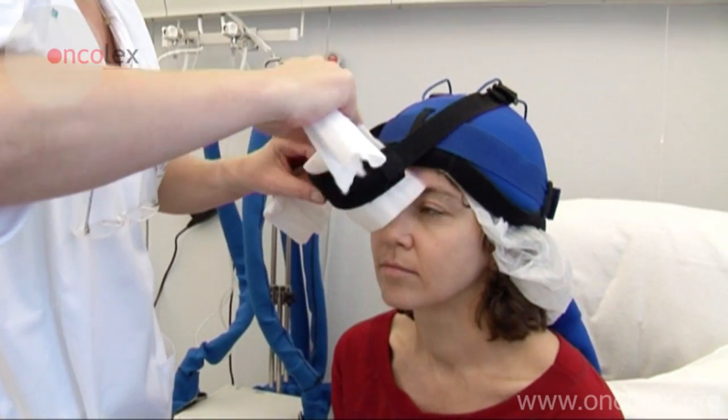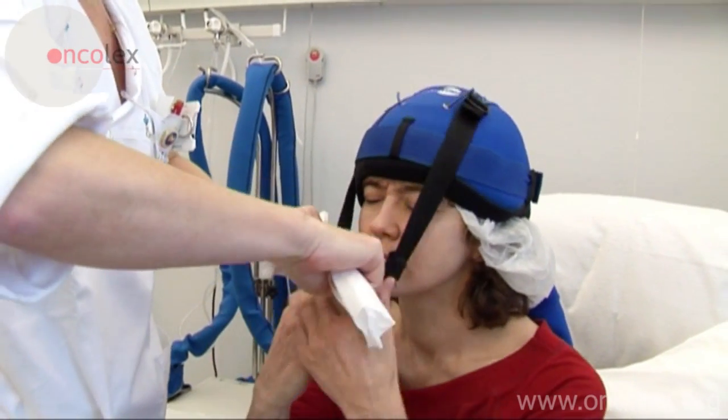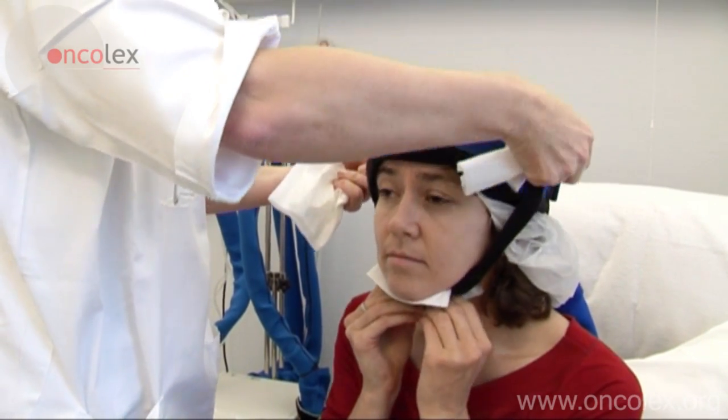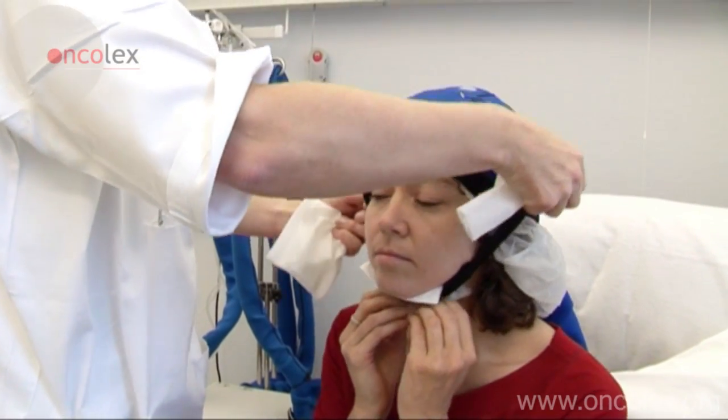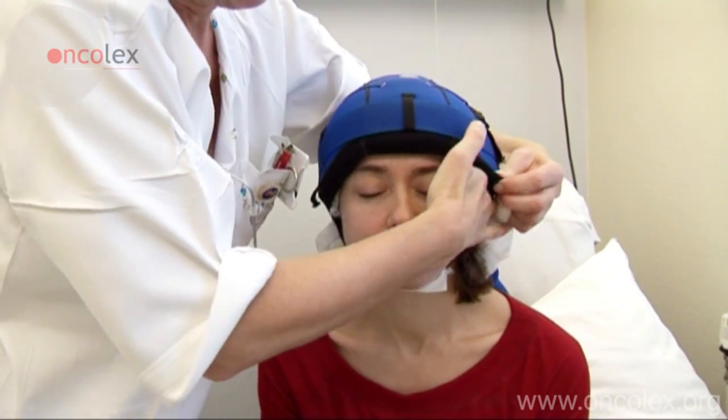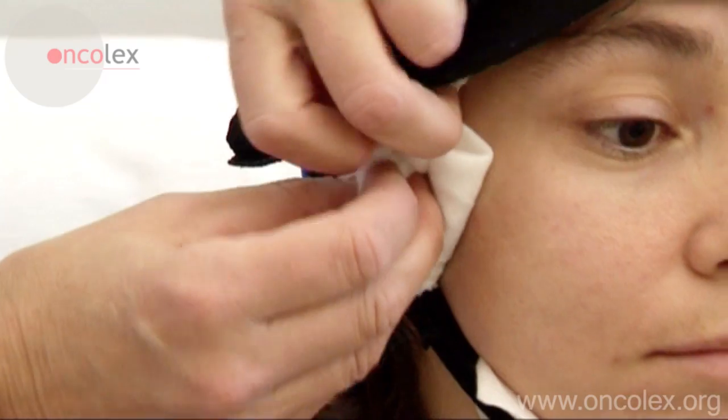The strap should be fastened under the patient's chin and padded with 2 sponges. The patient can adjust it for maximum comfort. The strap should be tightened so that the cap sits as closely as possible. To keep the patient's ears and forehead from the cold, they can be protected with sponges.